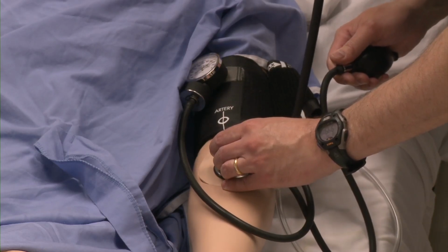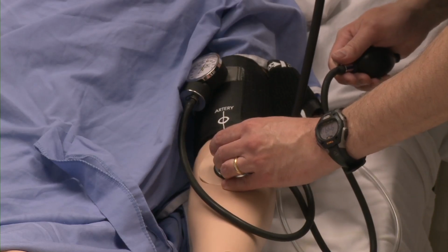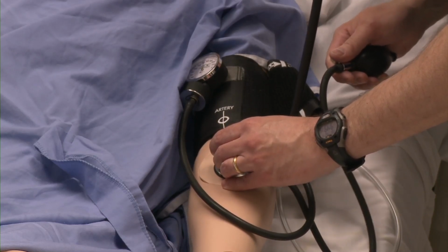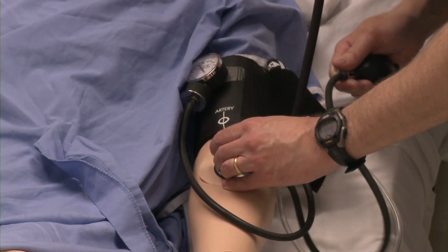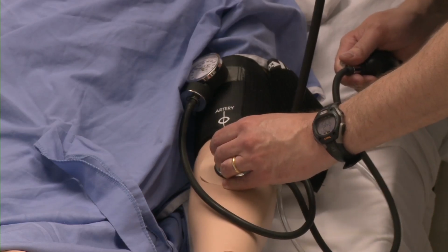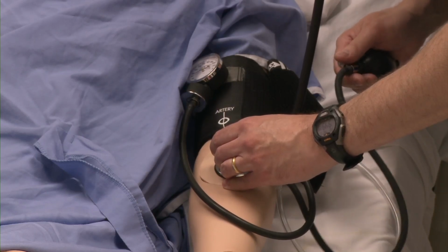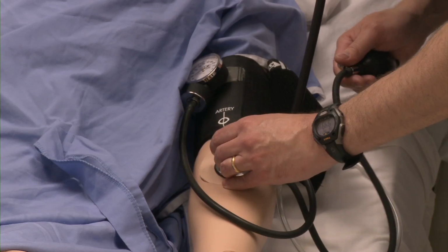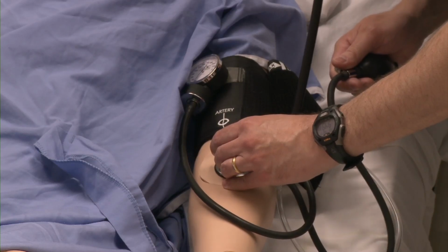Please note that the sounds made by SimMan are not consistent with the Korotkoff sounds made by a real patient. A real patient's sounds would be pulsatile or almost like a whoosh. SimMan's sounds are more like a click or tapping noise. You may have to listen very carefully to hear SimMan's sounds. If you are having any difficulty measuring the blood pressure, please say so out loud so that the people in the control room will know that you're having difficulty.